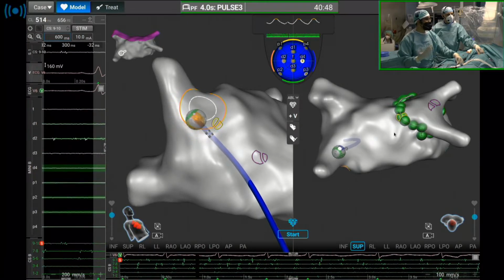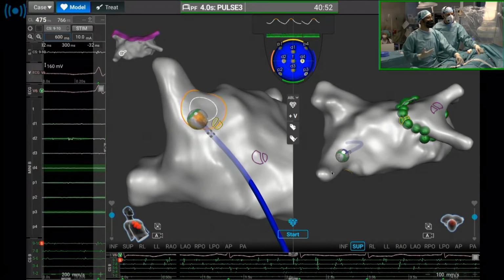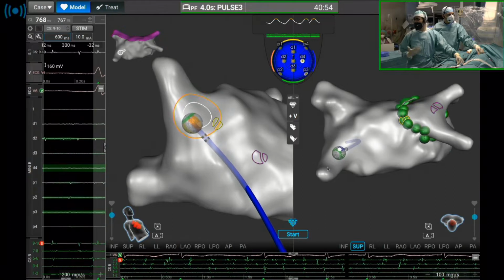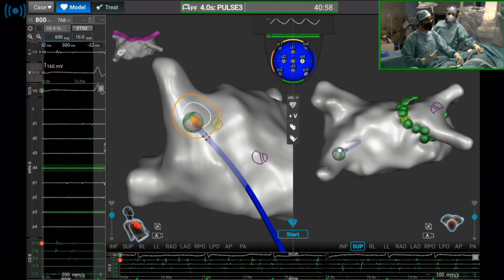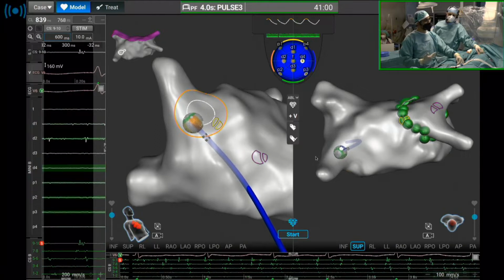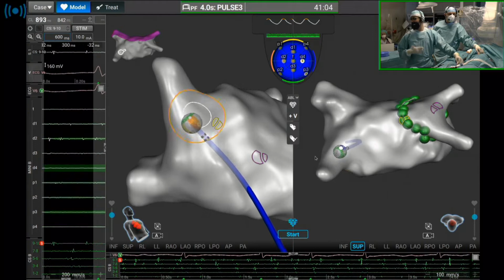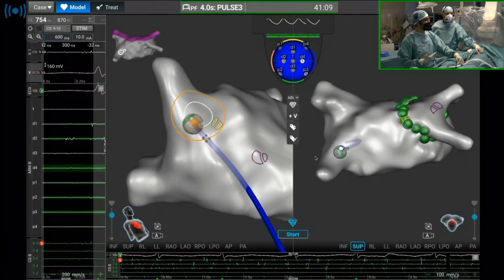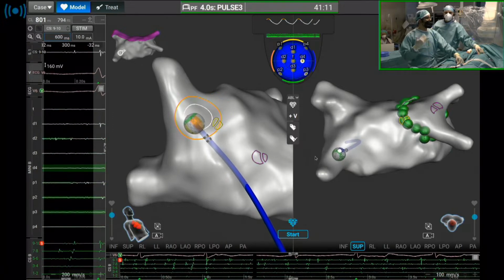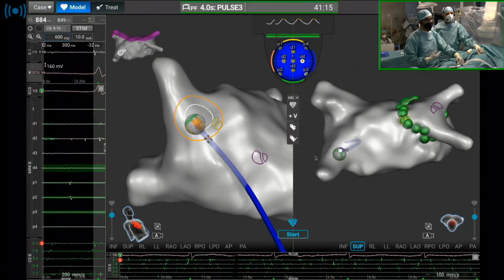If the patient transitions into, or terminates his AFib, that will be great. If he transitions to an atrial tachycardia, we'll show you the utility of this high-resolution mapping system to map atrial tachycardias. But if he remains in atrial fibrillation, we'll cardiovert the patient and stimulate to see if we have an organized reentrant tachycardia that we can map. But regardless of this, we are going to do a mitral line and a CTI.